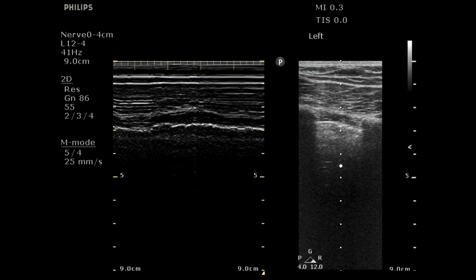If you have a tension pneumo, I suspect we'd see signs of pneumo no matter where you put your probe. Again, not 100%, but it's just kind of a general gestalt type thing. Certainly you can slide up and down and look at the entire anterior lung fields in a supine patient, definitely rule out the pneumothorax. But we don't see anything obvious. So in this situation, time is of the essence. You have a lot of other things to look at. I'm going to go look at other things, and I can come back if I need to circle back here.